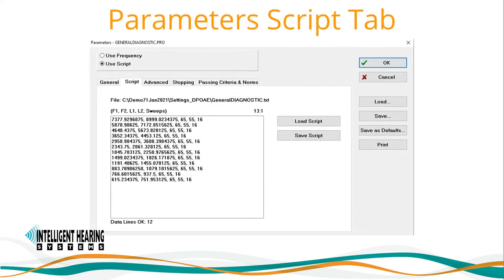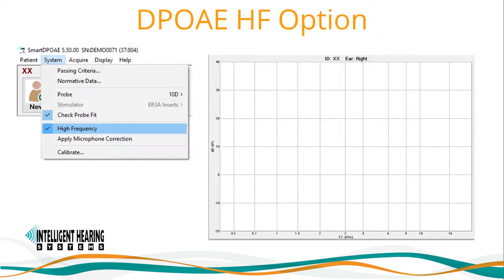If you choose to use the script mode, certain parameters in the general tab will be grayed out and the frequency tab will be replaced with the script tab, where you can define your protocol frequencies, intensities, and sweeps exactly as you want them on multiple data lines. You can use the Save Script and Load Script buttons to create and reuse script files.